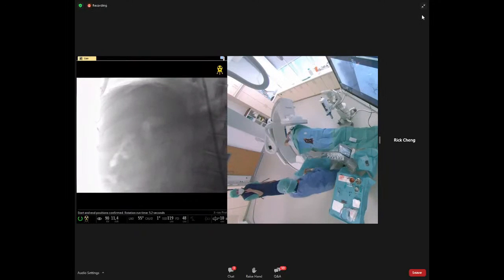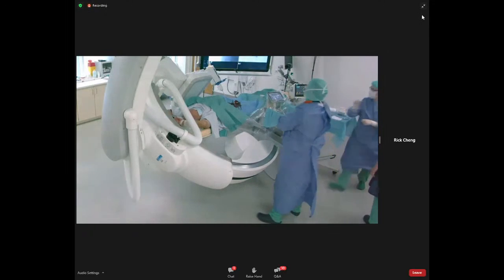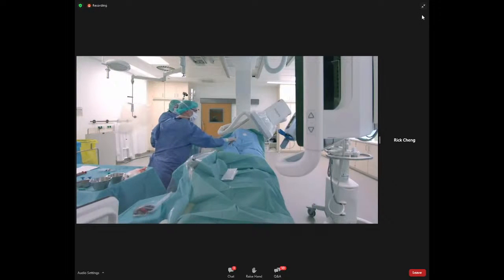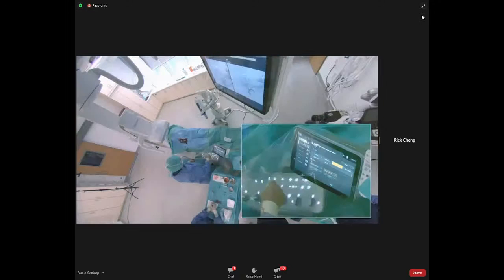Check in the lateral position that the liver is in the region of interest by pressing the fluoroscopy foot pedal. Make sure when doing this that you only adjust the height of the table, since we already centered the liver in the AP position.